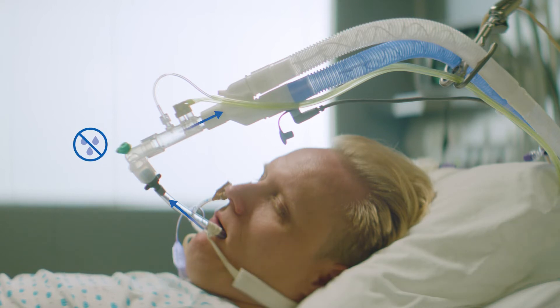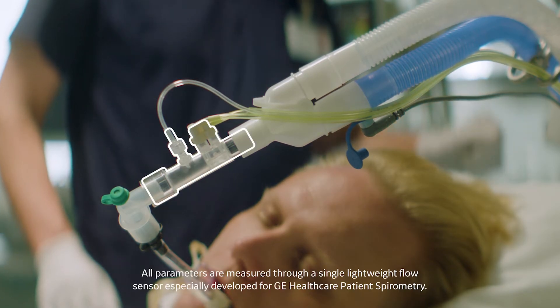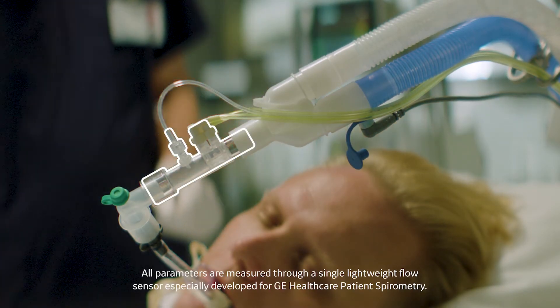Place the sensor upwards with a 25 to 35 degree tilt angle to prevent condensed water from entering the sensor interior and the tubings. The D-Lite++ flow sensor set allows simultaneous measurement of airway gases, lung mechanics, and metabolism. All parameters are measured through a single lightweight flow sensor, especially developed for GE Healthcare patient spirometry.